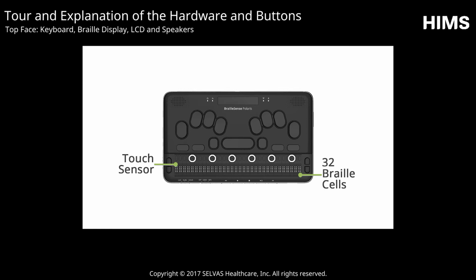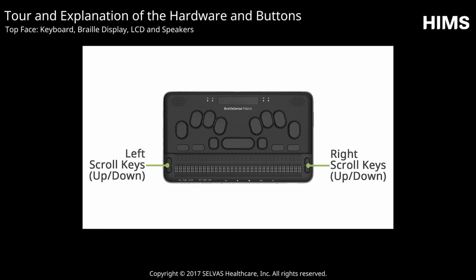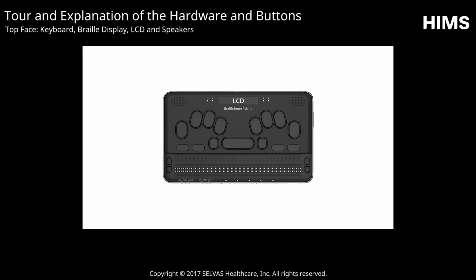You can use these gestures for navigation and selection, to open and close menus, and to open the global options. On each side of the Braille display is a set of scroll keys. These 2 sets of scroll keys can be configured independently in the global options to move by paragraph, line, sentence, character, or display length. Above the Braille keyboard is an LCD.